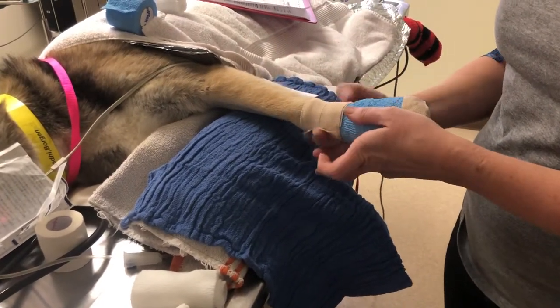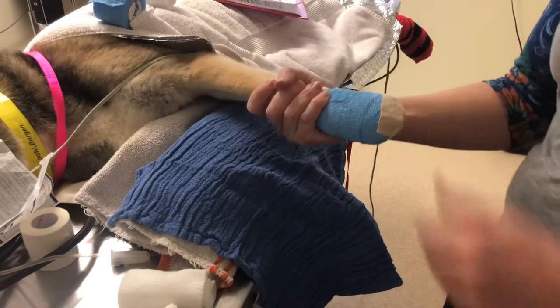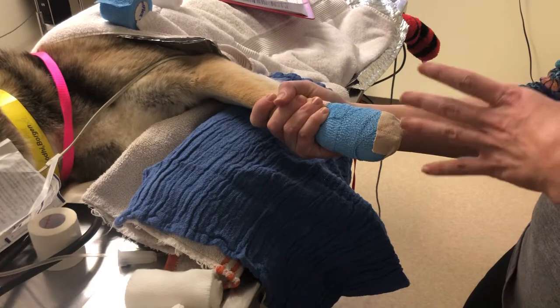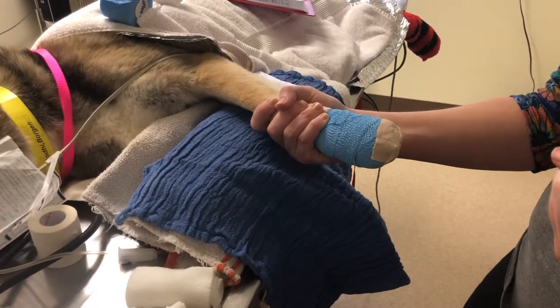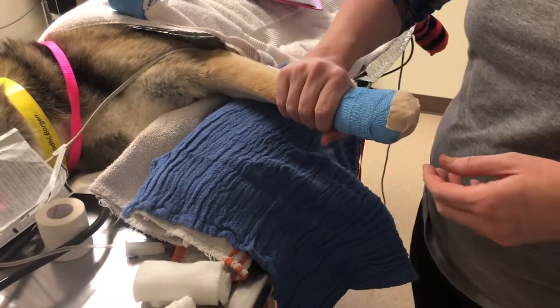I didn't pull at all. Then I warm the elastikon up with my hand by squeezing it — the warmth makes the adhesive very, very sticky and it will stick well to his skin up here.